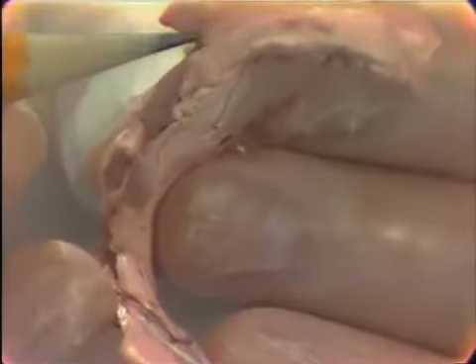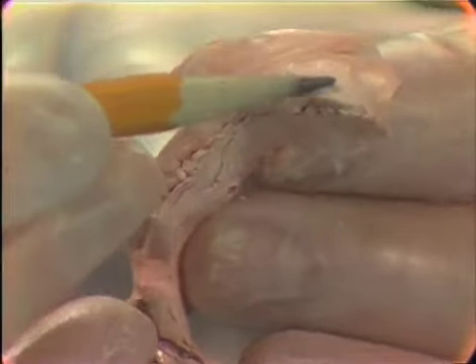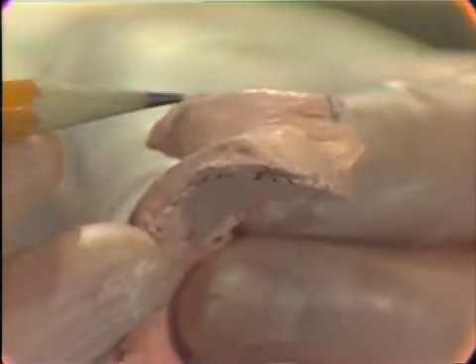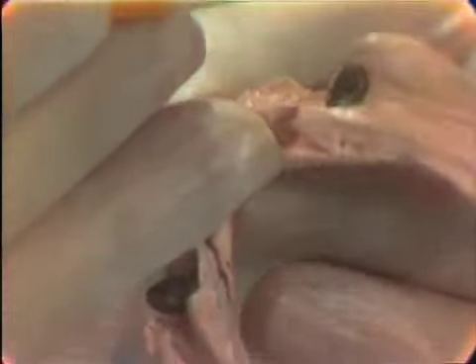Then we follow around to make sure we got a complete peripheral outline all the way around the impression. The tray is showing through a little bit there. We would want to reduce that, cut the tray back so that it doesn't show through. The periphery looks pretty good. It's showing through a little bit there. So we would mark that, trim the tray back a little bit.